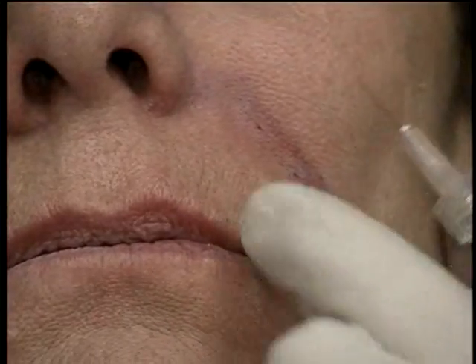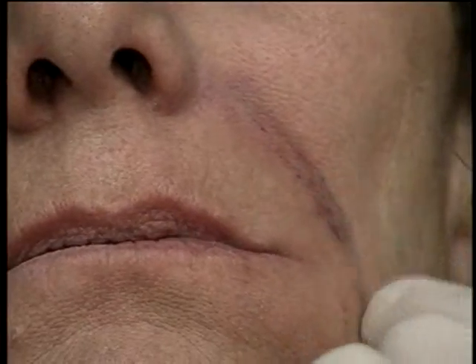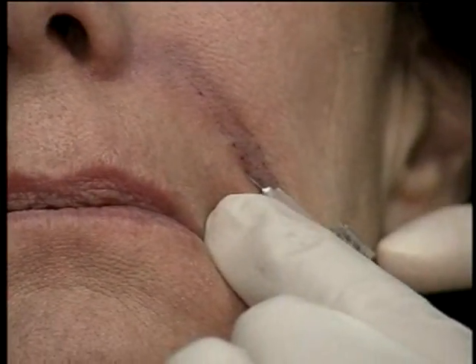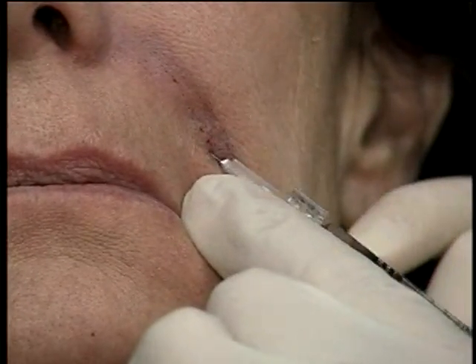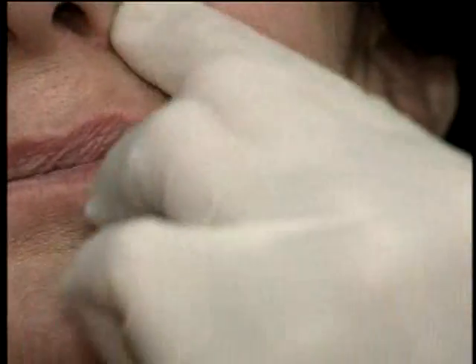And that's filling in pretty nicely. I may check and see if I feel any areas where I could use a little bit more. I think right here I feel like it. So I'm going to put a little bit more in there. Moving slow and purposefully so as not to get bruising. Massaging it afterwards.